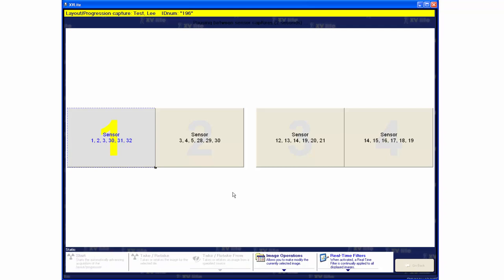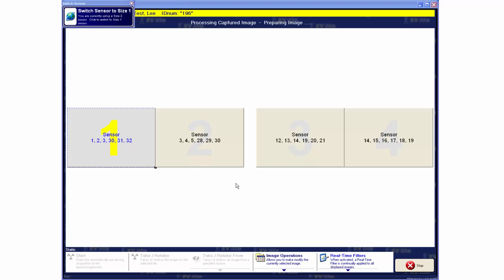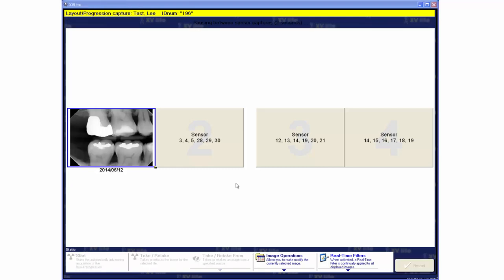The operator then positions the QuickRay sensor in the patient's mouth for the first X-Ray and triggers the X-Ray generator. The image is captured by QuickRay, enhanced, and displayed on screen by X-VLite.